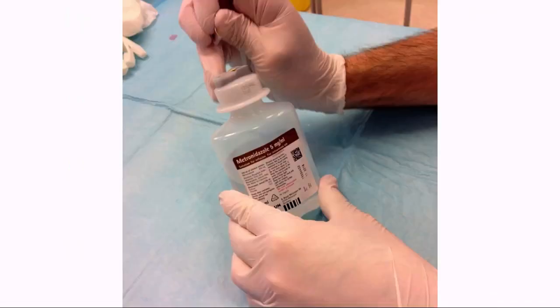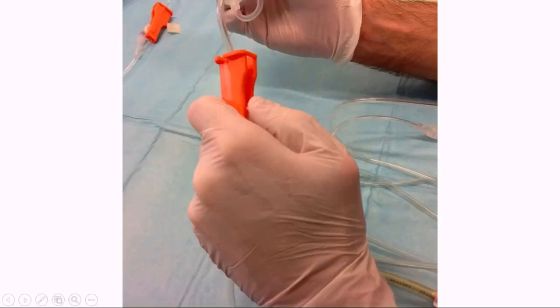Then we're going to run the metronidazole through a giving set. So first of all, we take off the foil cap here, and we close the roller clamp of our giving set.